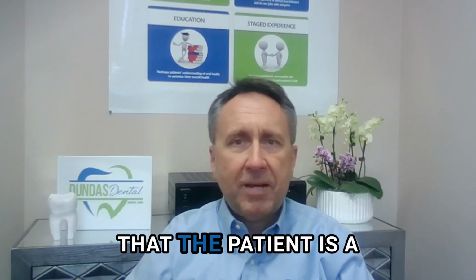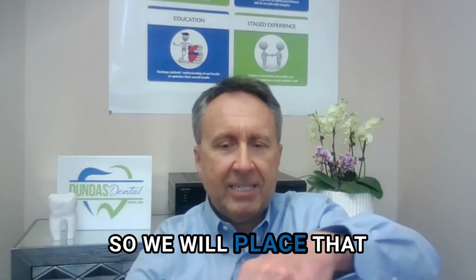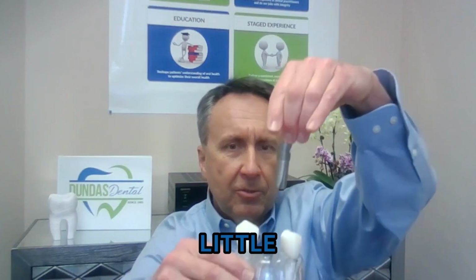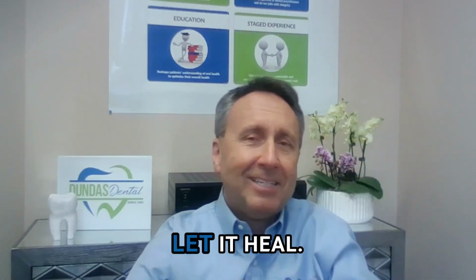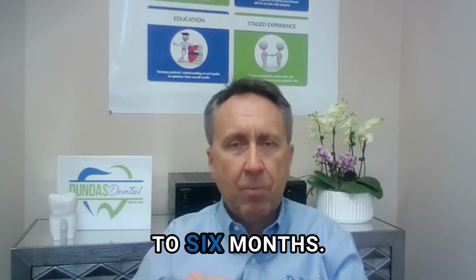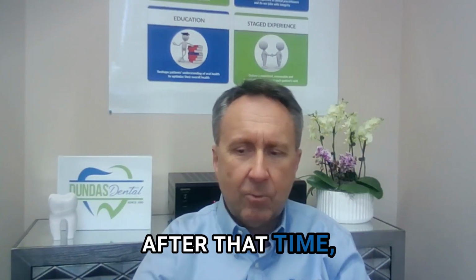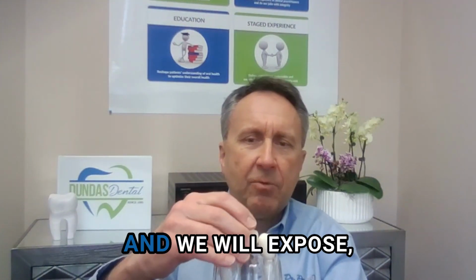So once we determine that the patient is a good candidate for an implant, we will book an appointment and we will place the implant. So we will place that little tooth replacement, the screw as you can call it, in the bone and we'll let it heal. In general, the healing will take 3 to 6 months. After that time, we will bring the patient back. We will see how the implant is and we will expose, as we call it, the implant.